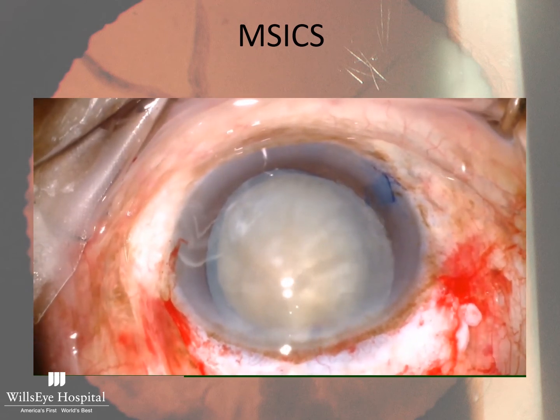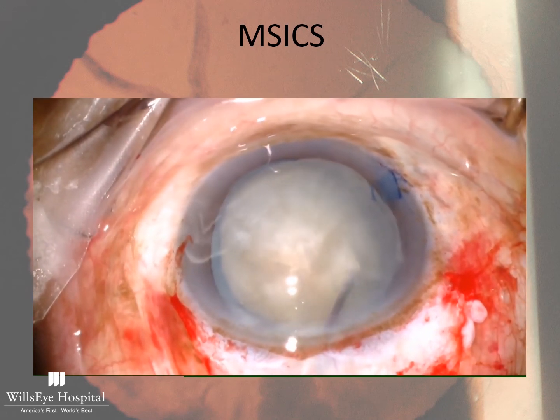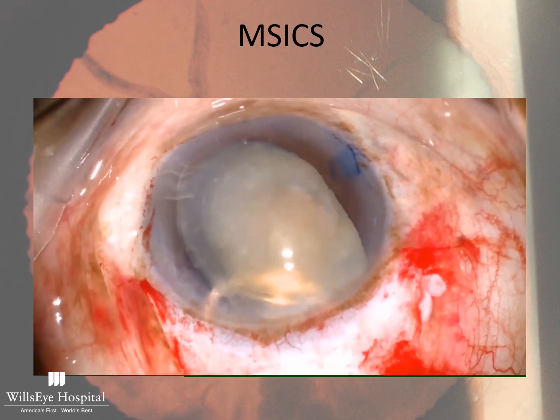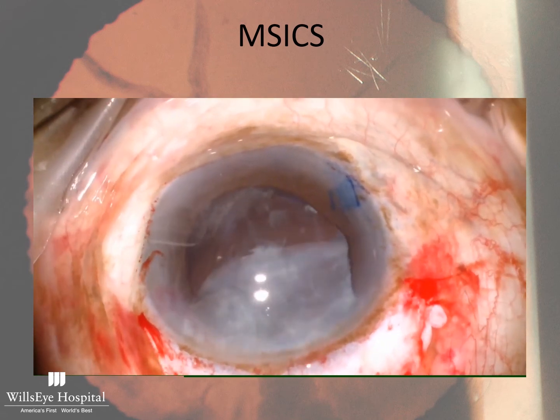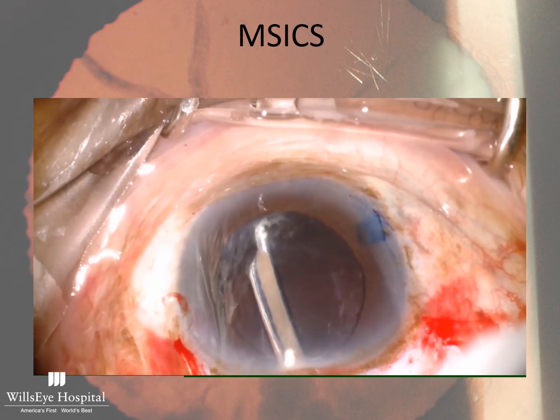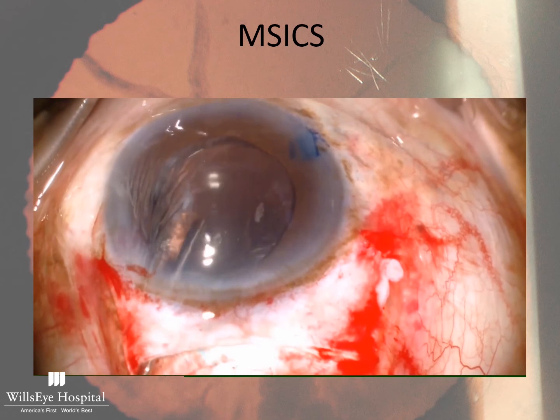I've hydrodissected and I'm rotating the lens out into the anterior chamber. I'll place viscoelastic behind the lens. This is an irrigating vectis, irrigating fluid into the eye, pushing on the posterior lip of the wound and allowing it to prolapse out of the eye. This is a Simcoe IA. It's manually controlled. You can see some chamber fluctuation related to going through the main wound.